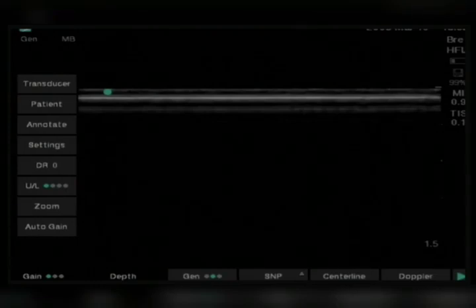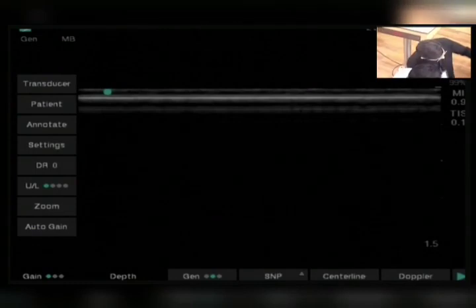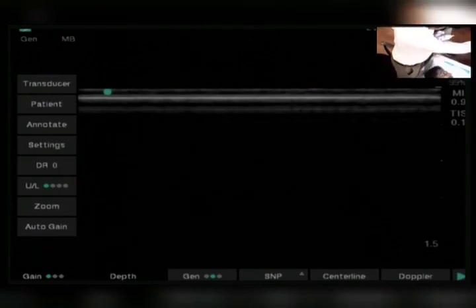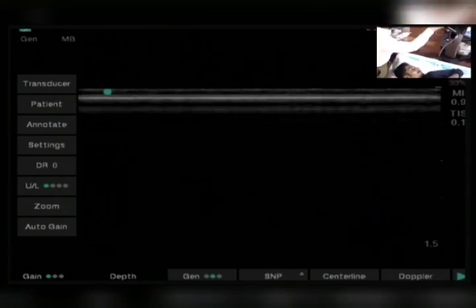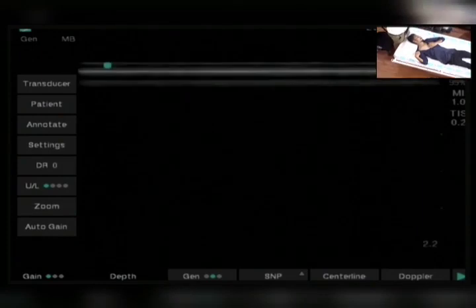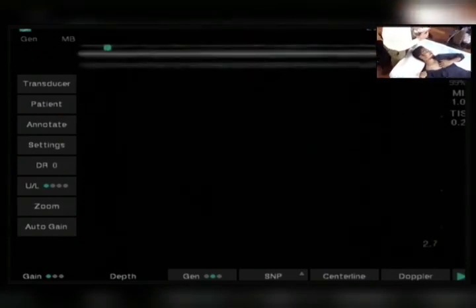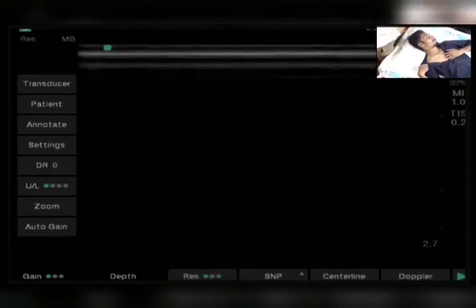not working. So here, we change in general to resolution mode. High frequency linear probe is over here. It is okay, and depth is reasonably okay. Gain and depth we can adjust. Can we change this to resolution mode? No, this is general mode actually. Okay. So in brachial plexus, the depth is less, so I mostly utilize the resolution mode.